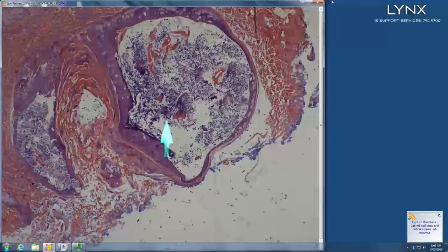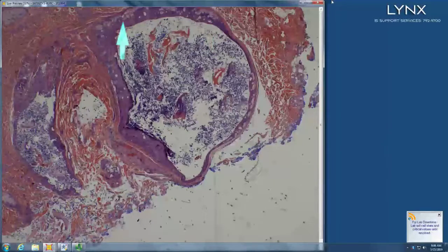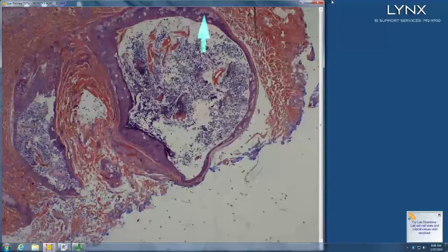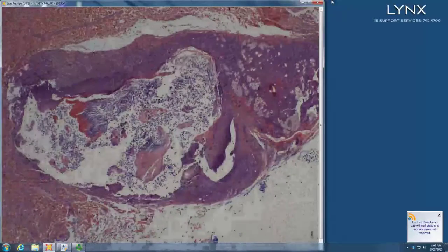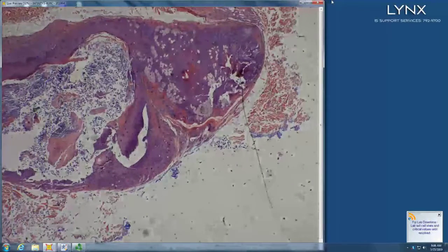Dermoid cyst, or since it's mainly sebaceous there, follicular sebaceous cystic hamartoma would be the other thing. So dermoid, if they're better developed into follicles and you see some eccrine in there maybe too, or just follicular sebaceous cystic hamartoma. And sometimes they exist on a continuum, so it's fine to have some overlap there. Okay, let's do this one.